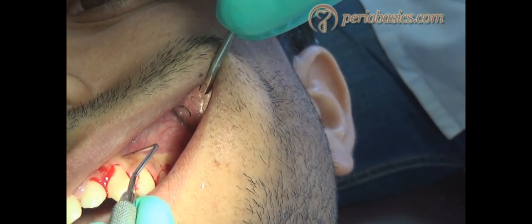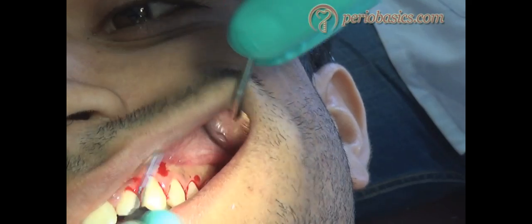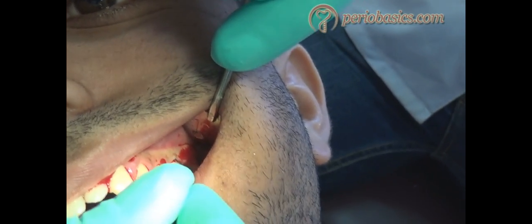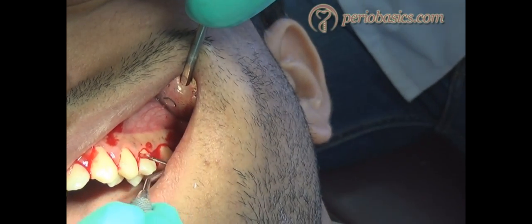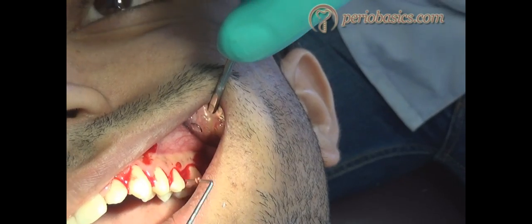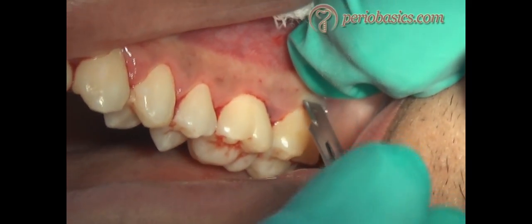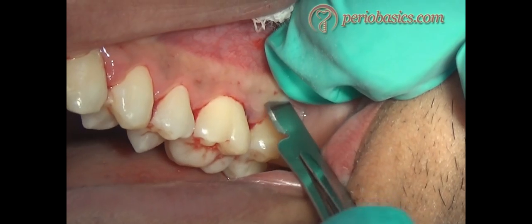Before we put the incision, we do bone sounding to find out the margins of the alveolar bone. Bone sounding is done by putting the periodontal probe horizontally and vertically and feeling the resistance from the bone. After we have visualized the bone margins, we start with the incision.